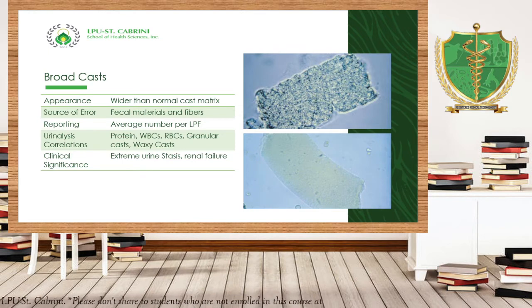Kapag po sinabi nating broadcast, that is wider than the normal cast. And the source of error for this one is the fecal materials and fibers. Take note guys that broadcast is correlated with extreme urine stasis and renal failure.